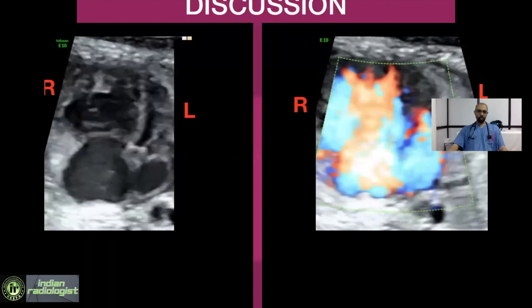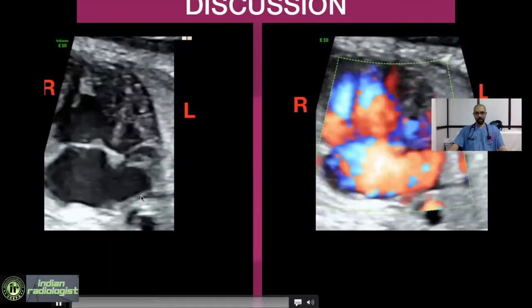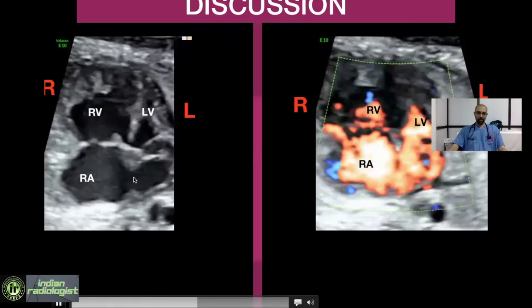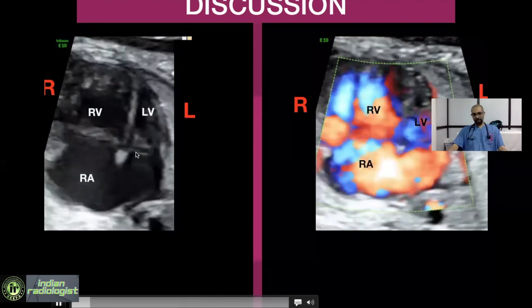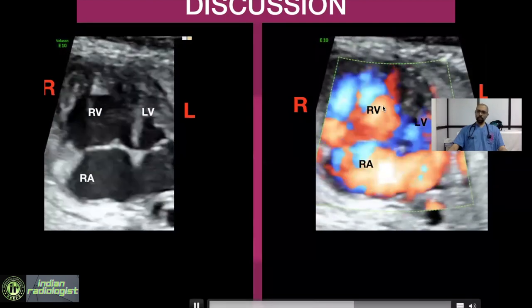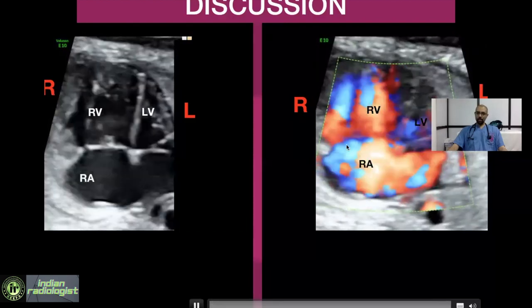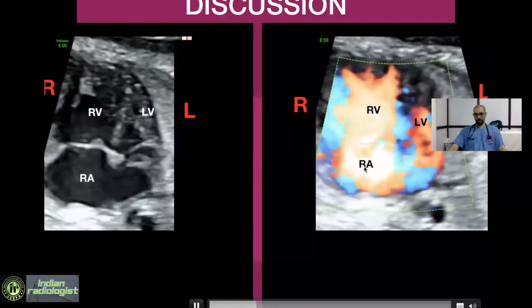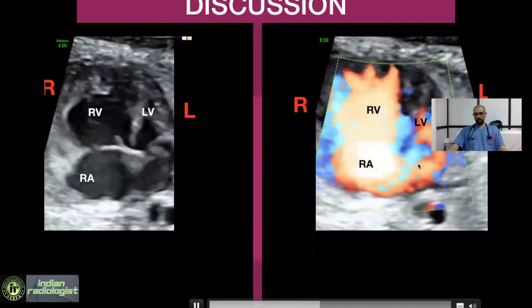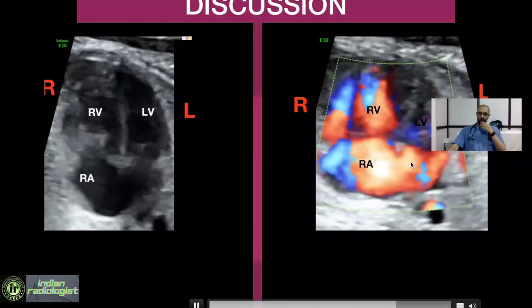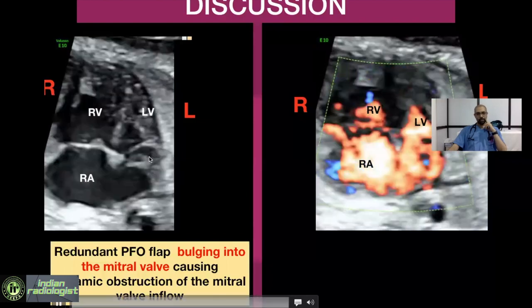What we can see here is a four-chamber view. The atrial septum has become aneurysmal and has actually moved into the LA, also encroaching upon the mitral valve. In the color view, we can see the flows across the mitral valve into the LV are minuscule in comparison to the flows across the tricuspid valve into the RV. We can clearly see ventricular disproportion in both the 2D and color images, with a redundant PFO flap bulging into the mitral valve.